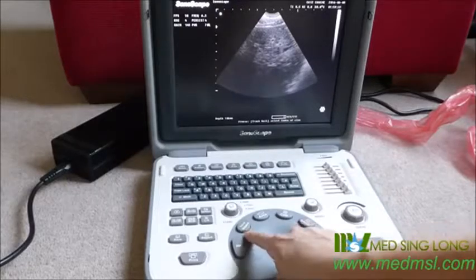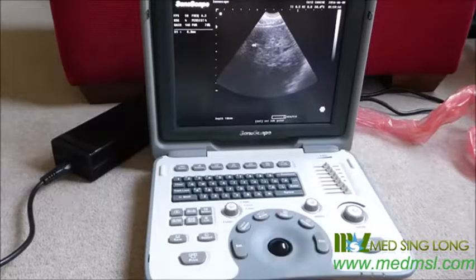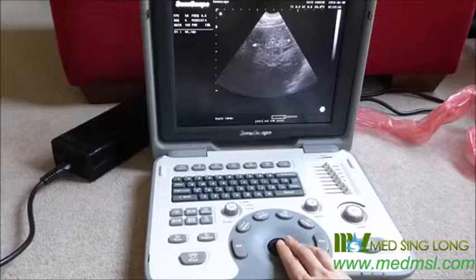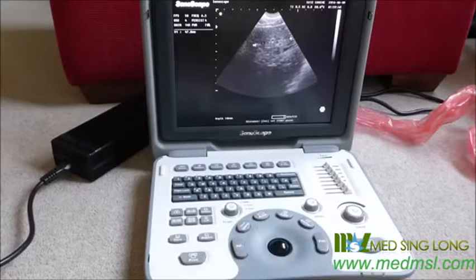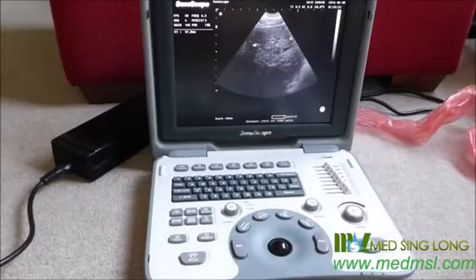There's a distance button here. You press that and you would just set your point here and then wherever you wanted to go to, imagining a sac again, but say it was there, and then it's going to come up on the screen, it's going to tell you the distance between those 2 points.